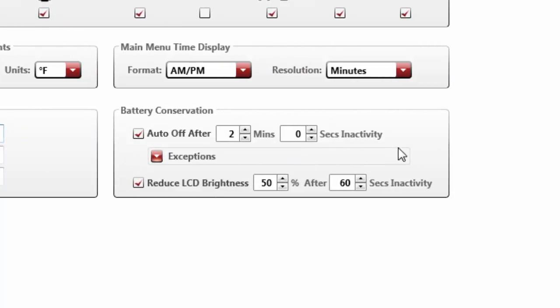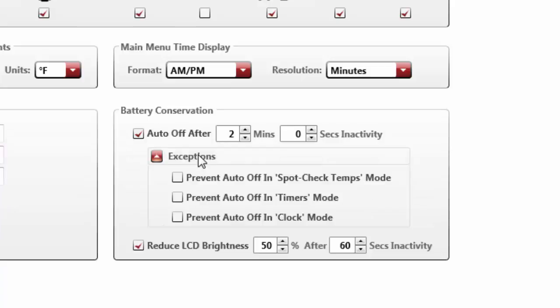The last section of this tab is the battery conservation settings. Here is where you can adjust the length of time until an unused Temptaker powers down automatically and/or dims its display. Additional settings, found under the Exceptions toggle, allow you to customize certain applications that, if left on, would keep the Auto-Off feature from executing.